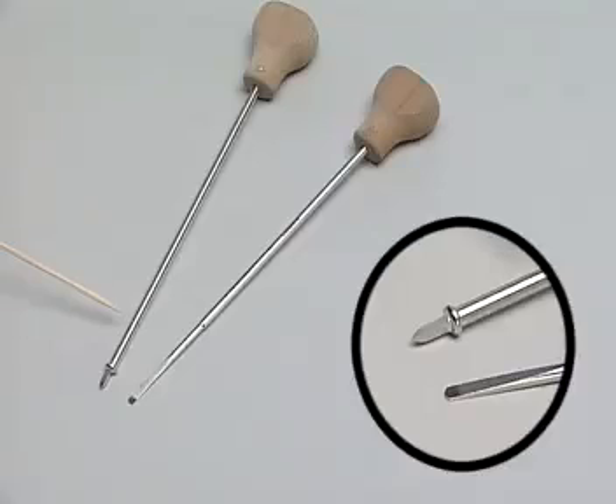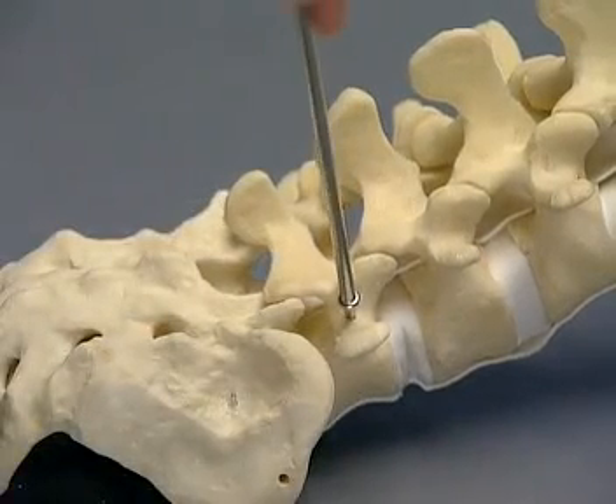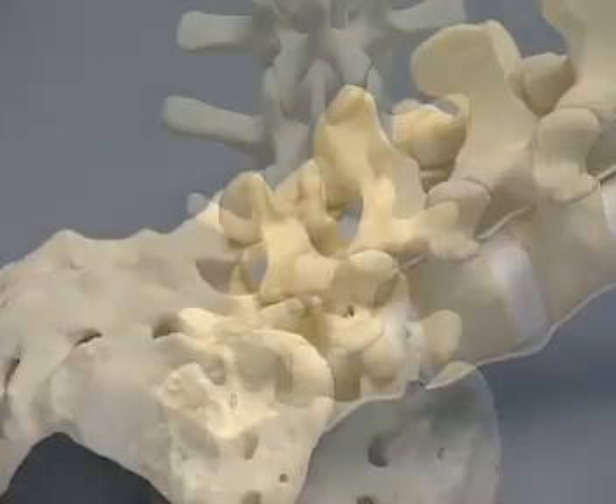The instruments used to open the pedicle are the USS Pedicle Awl and the USS Pedicle Probe with depth markings. First, the pedicle screws are inserted in the usual manner. The hole is started with the Pedicle Awl and completed with the Pedicle Probe; the markings show the approximate depth.